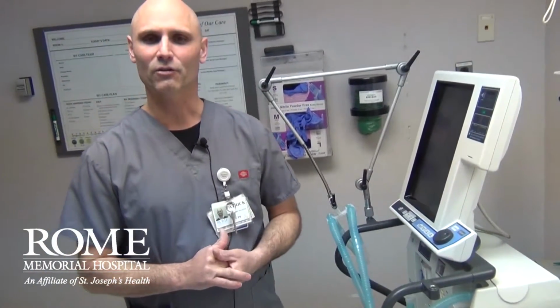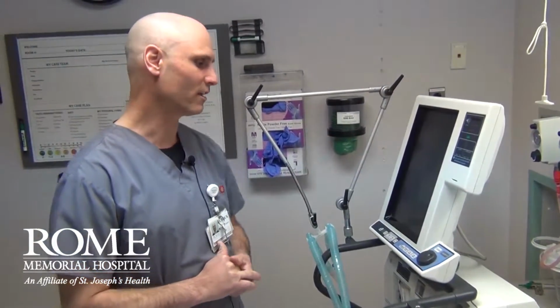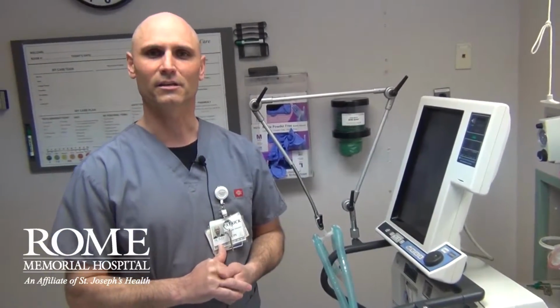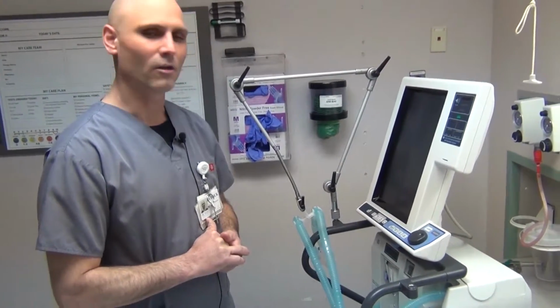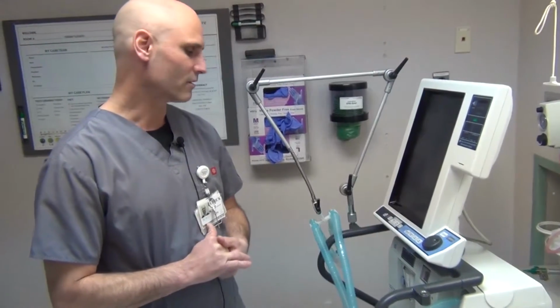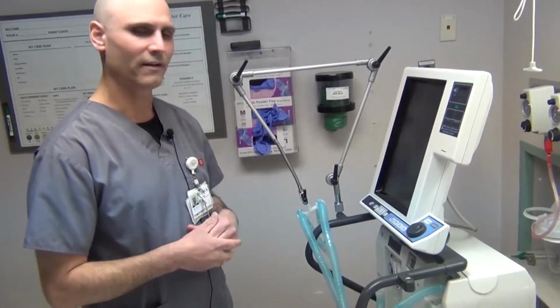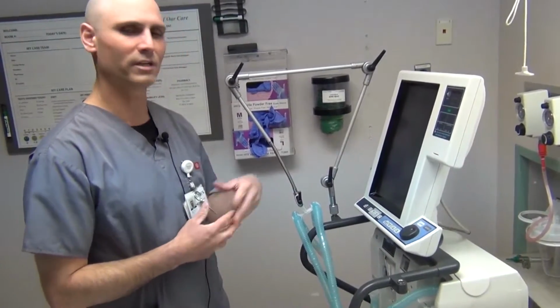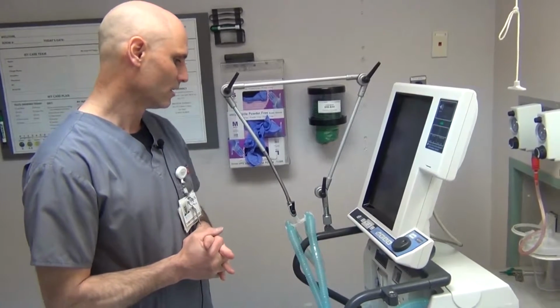Today we're going to do a little bit of a crash course on how to set up and use our ventilators to assist in the crisis that could be coming. First of all, when you get the ventilator out of the supply room, it'll come taken apart, and you'll have to set it up and then put in some settings before the patient is connected to the ventilator.